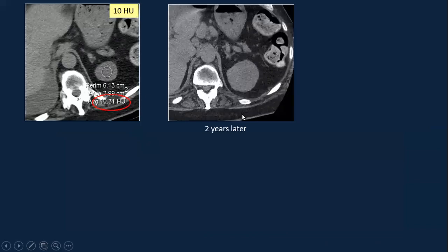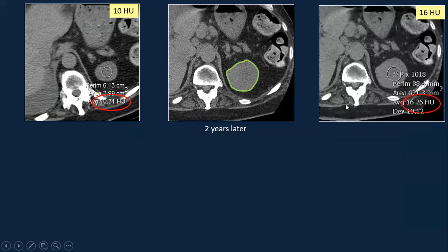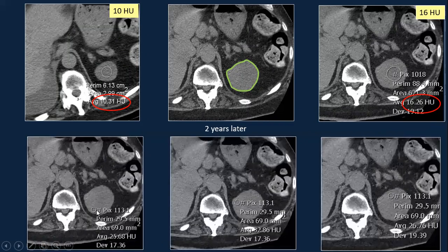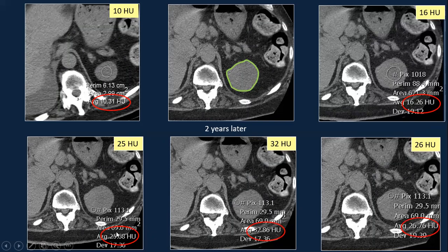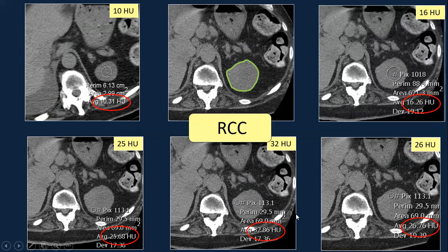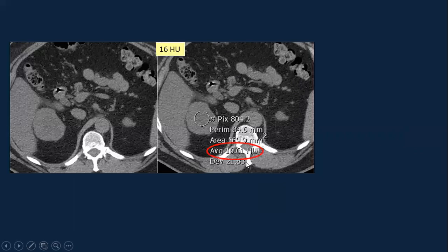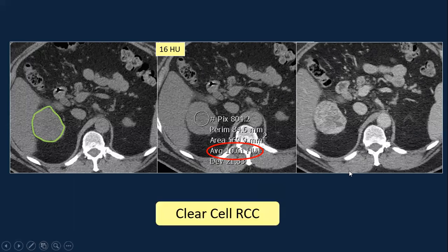Here is an example: a patient had a left renal lesion measuring 10 Hounsfield units — it looked pretty homogeneous and smooth. Two years later there was a dramatic increase in size, and the shape of the lesion was no longer round but wavy and nodular at the surface. Placing a large region of interest gave 16 Hounsfield units, but small peripheral regions of interest gave values well above 20 — and this ended up being renal cell cancer. Another example: non-contrast CT measured 16 Hounsfield units, but the shape was not quite round, and contrast confirmed a solid renal cell cancer.